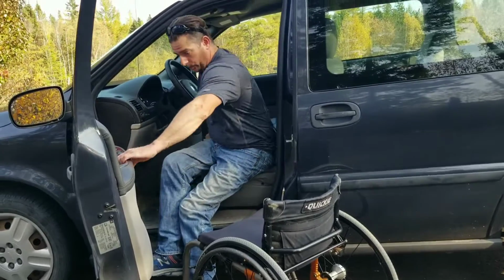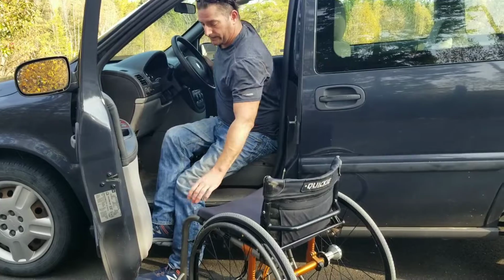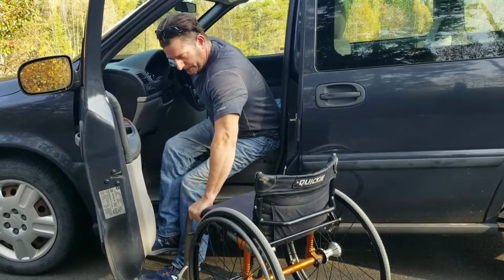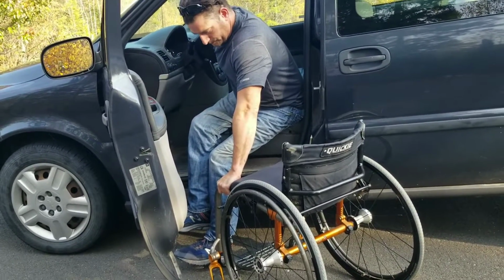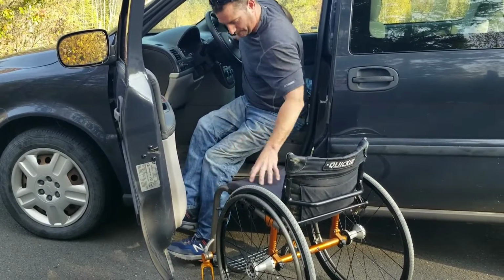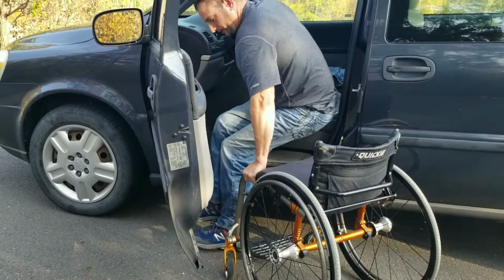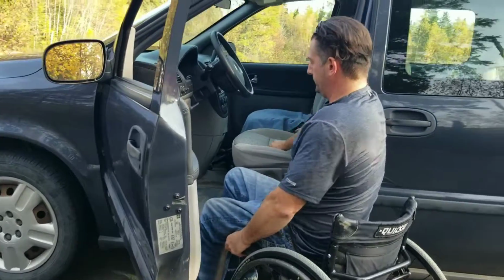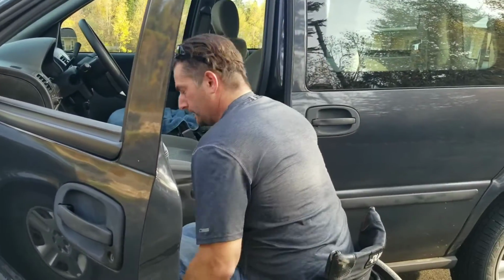Some people grab the door and lower themselves down, but for me personally, I find that I'm putting my hand on this chair because I don't want that chair to get away on me. So when I transfer down, I know for sure that chair is not going to be going back behind me or off to the side or anything. I have a good firm hold of it, and I'm pushing it up against the sill of the van too, so it's not going to go anywhere. Just gently pivot, put my hand here, I plant to my hand, and I pivot down into the wheelchair. That's how you get out.